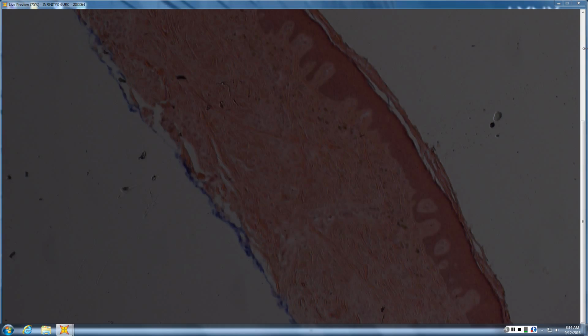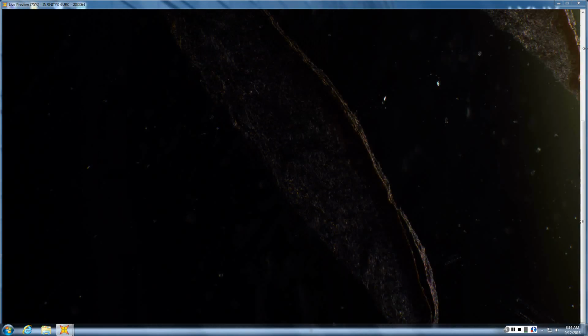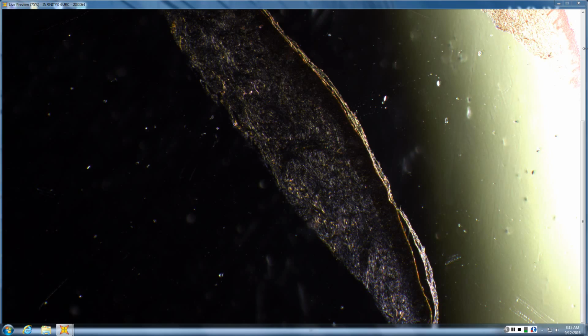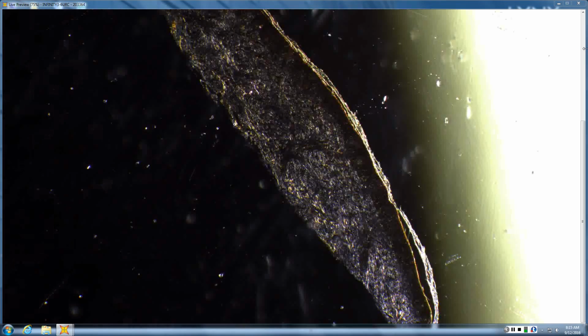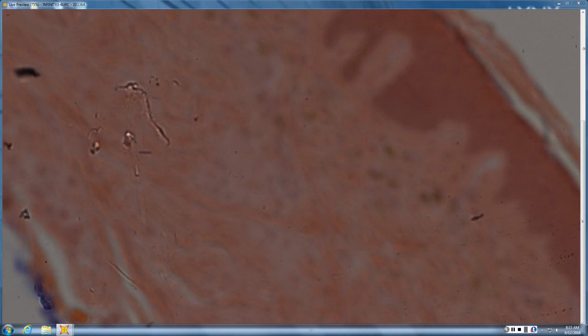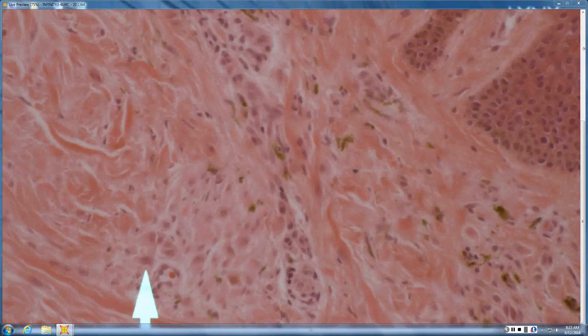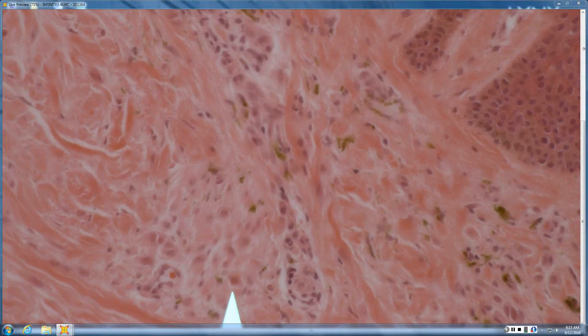One of the other things you can do is let's go back to 2x and look. It seems undecided. I see some dark areas of pigment in there, so maybe we have some theques of blue in there in that sclerotic stroma. Can't really tell. Let's go a little higher. What do the cells look like? Those guys look a little more epithelioid. Yeah, more epithelioid. Any kind of purely dermal epithelioid nevus with sclerotic collagen?